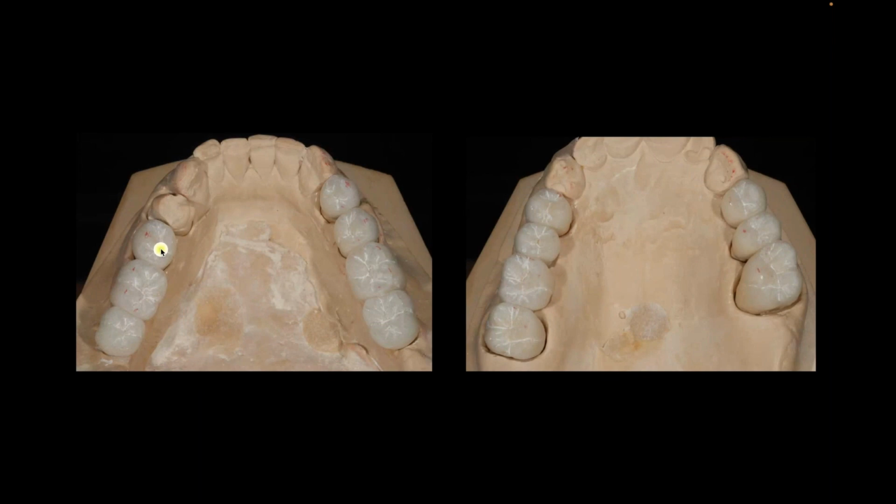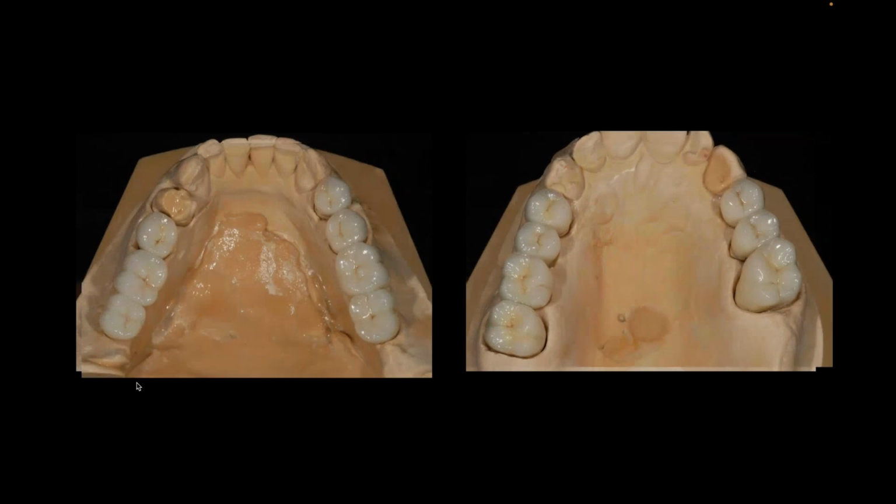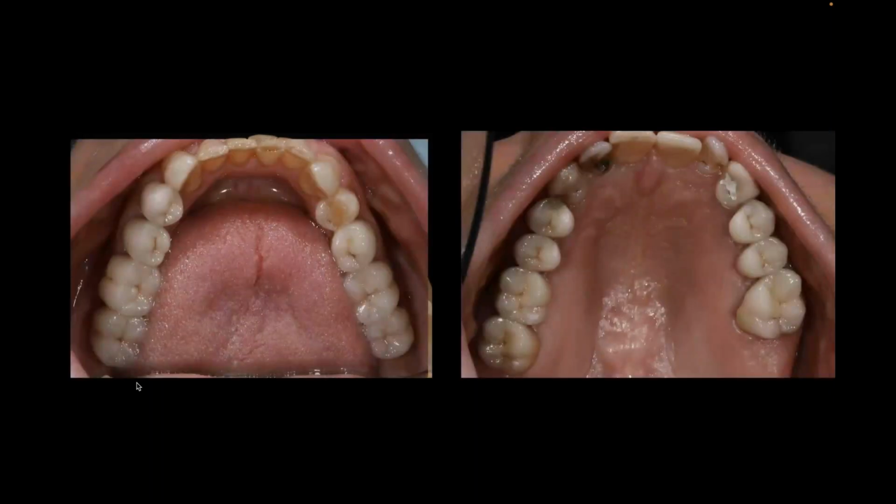So you can see that here on lower teeth, you see my functional dots. And I want to make sure if I actually have three dots here, right? Two cusp tips and a marginal ridge, I'm okay with that. I have one dot on a bicuspid. And maybe I'll have a graduated occlusion where I'll only get one or two dots on that second molar because I don't want it hitting closer to the center of rotation, which is my condylar position. My job is to work through that process so that when it goes intraoral, not only does it look proper, but it functions proper.